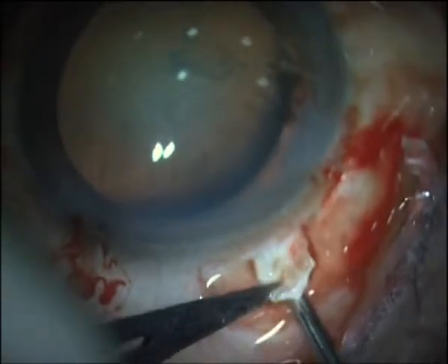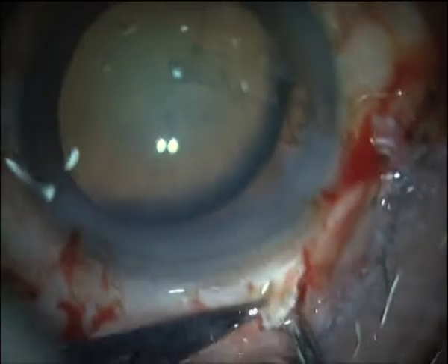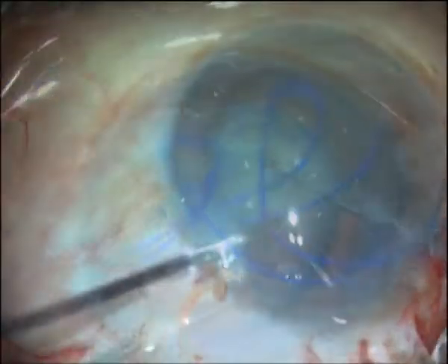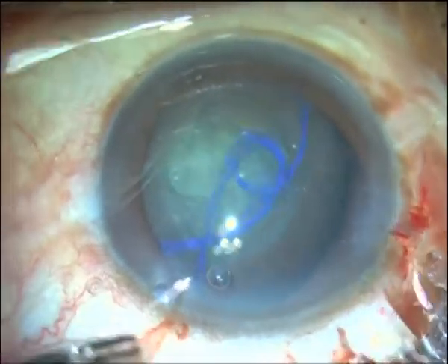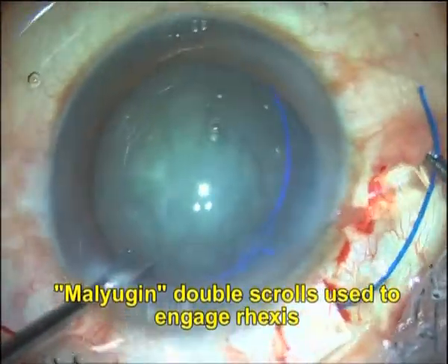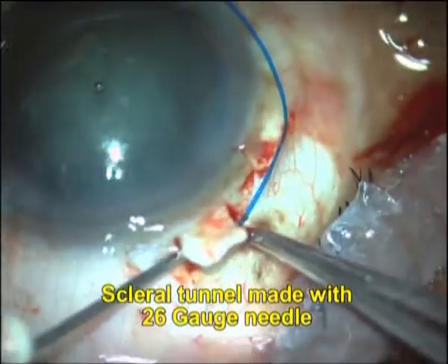A sclerotomy is made under the scleral flap with a 20-gauge needle, about 1.5 mm from the limbus. The two arms of the ring segment are inserted into the capsular fornix. The haptic is exteriorized out through the sclerotomy. Once the rexis margin is engaged by the scrolls, pulling on the exteriorized haptic pulls the entire capsular bag complex and centers it.